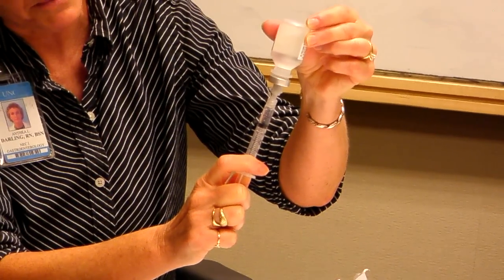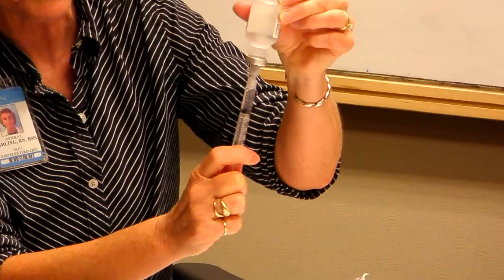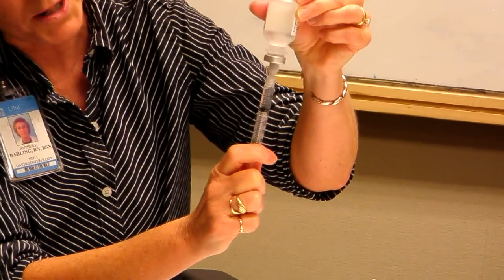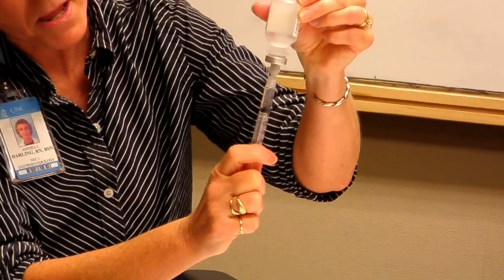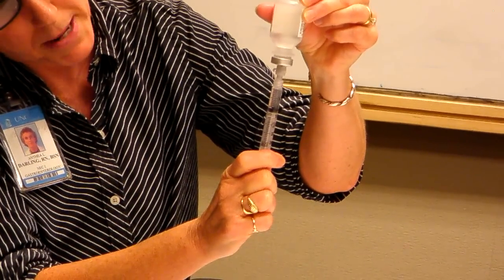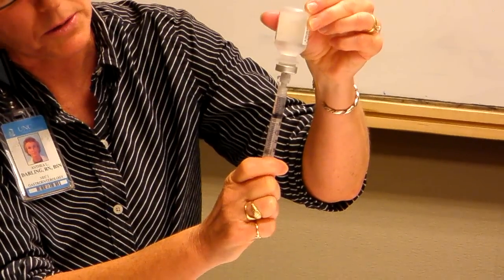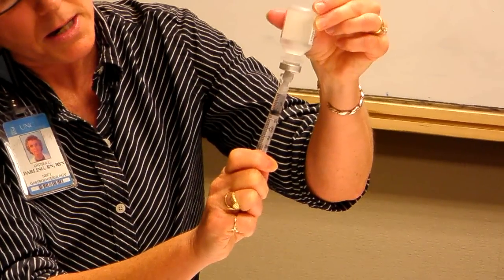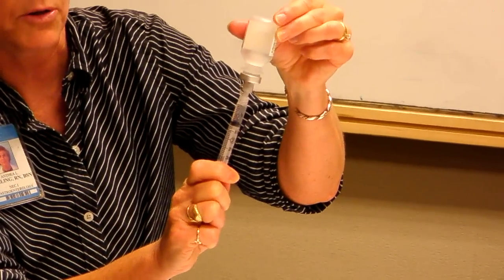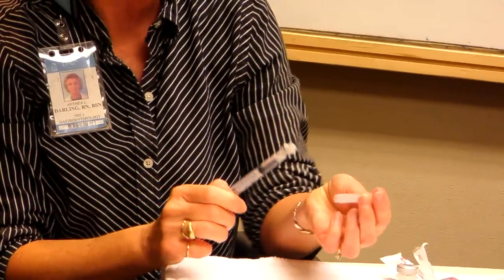In this case, I'm going to be giving myself 1 ml, 1 milliliter of a solution. Now, I don't know if you can see this, but I'm drawing it just slightly past the 1 ml portion. There's a tiny little air bubble at the top. I'm just going to push that air bubble back up into the vial until I get to the 1 ml or 1 milliliter line. The little bubbles are not going to hurt you, but that may change the dose of the medication that you're giving. Once you're to the 1 ml, pull it out, and you're ready to go.